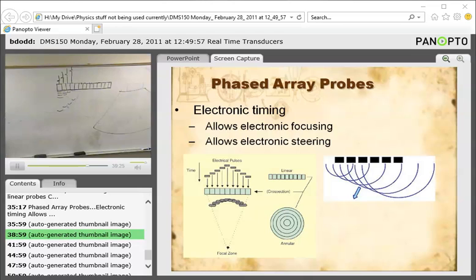Yeah, right. Like the little 3-vector one on the Sequoia in there. Yeah, that's exactly what this is. So now we get the same effect as we had with the mechanical wobbler probe, but we've done it electronically. And we've taken out all those moving parts that break down. So no longer do we have a probe that breaks down mechanically. We have a probe that is much more expensive to make and breaks when you drop it. But that's better, right?